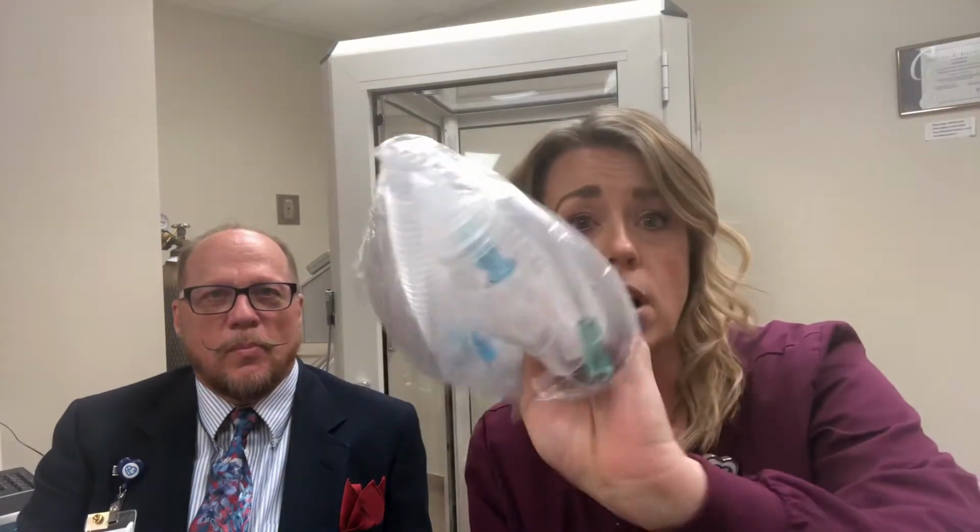So these are bronchodilators. They dilate the airway, so usually it's a duo neb, which is 2 drugs, albuterol and ipratropium bromide, and they're going to both help open up the lungs. Could be albuterol as well. So these are located in the respiratory closet. Some patients can do just the mouthpiece, and others need the mask. And so a lot of times we take both and ask them, or we just assess which one they can do. So you just open up the package.